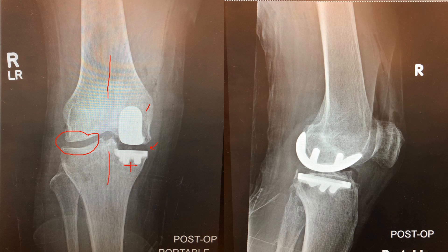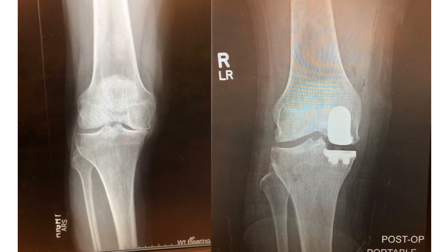We'll also look at the lateral view to make sure that we're appropriately sized front to back, with an appropriate offset and then an appropriate transition zone anteriorly. We'll then go back to our preoperative x-ray to evaluate the amount of correction. We can see preoperatively the bone-on-bone medially, the malalignment or varus angulation, as well as the tibial subluxation. All that has been corrected on the postoperative film. We now have a neutral alignment, the femur and tibia are mated, and we have balanced gaps on both sides.